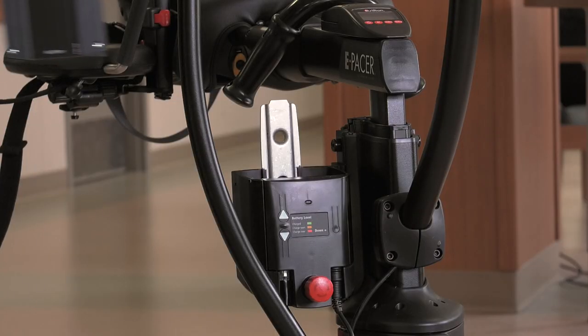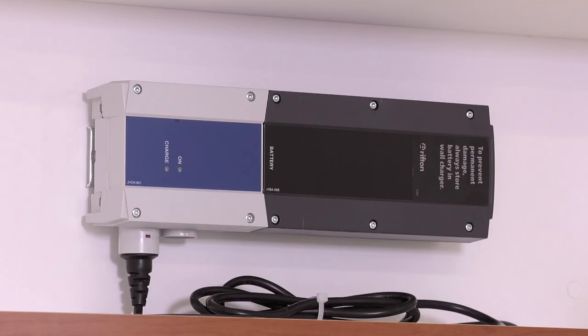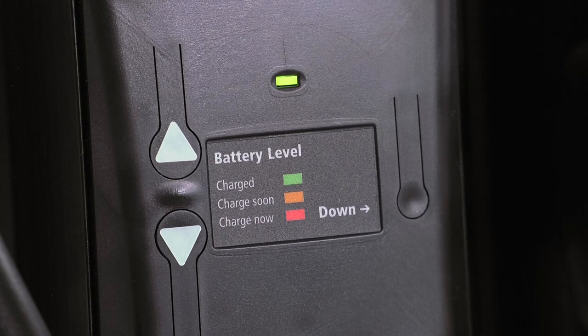Before starting the session, make sure a fully charged battery is in the battery box. Charge the battery overnight at least once a week. Do not start a therapy session with a battery that is on orange or red.